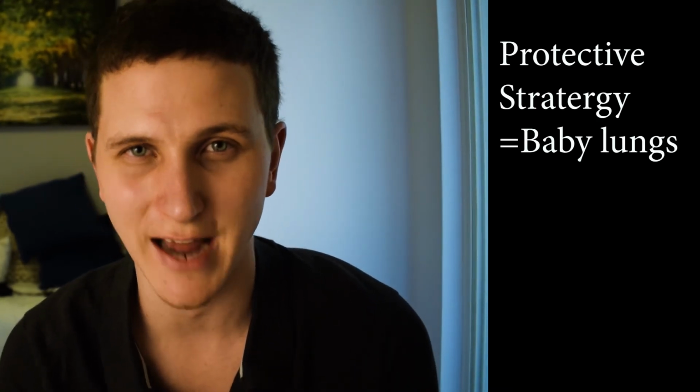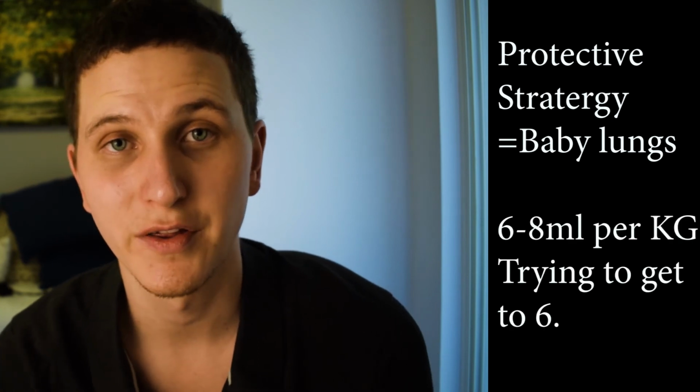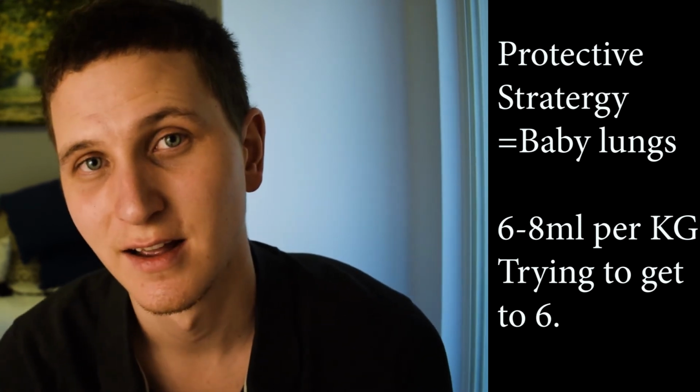So there are two general ventilation strategies. There is a protective strategy for everyone, and then there is an obstructive strategy, like asthma. The protective strategy is that you must think of damaged lungs like baby lungs. They're small. So we try and decrease the tidal volume as much as we can. With the protective strategy, we try and drop the tidal volume from 8 mLs per kilogram down to 7, down to 6. As long as we're getting enough ventilation, you can keep dropping it down to about 6, because damaged lungs are baby lungs.